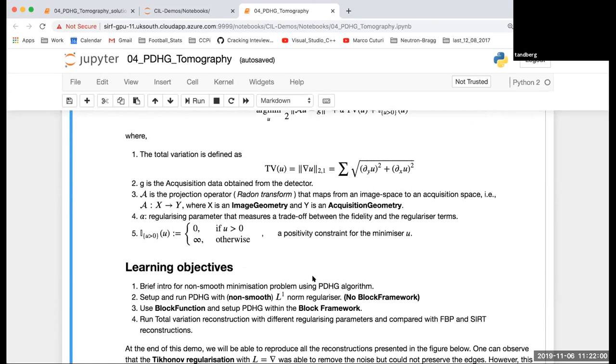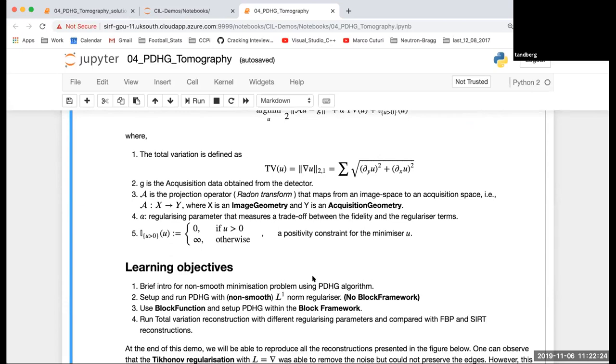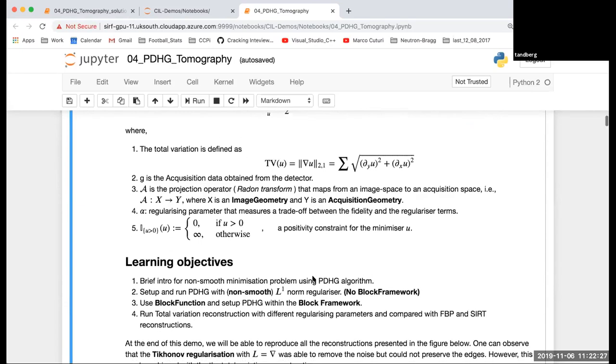The learning objective for this demo is to give a brief intro for the non-smooth minimization problem that we are going to examine. We will start with the L1 norm regularizer, which is not differentiable, and then go to block function and block framework and set up the primal dual hybrid algorithm.